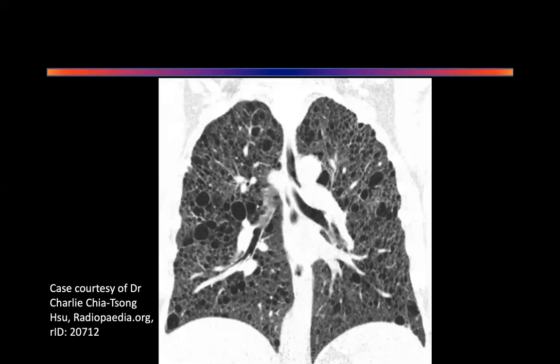To make out whether it is a bulla or something else, sir. So what are you thinking of? This is not fair to you, Biswarup. This is not a straightforward CT scan. Unfortunately, it's the first one which came up. It's quite a good understanding. Try to see whether these are pneumatoceles or any kind of cavitary lung disease. Okay, good. I'm happy with that.